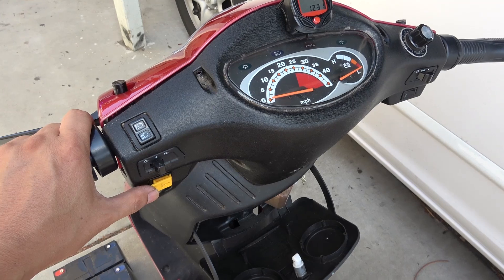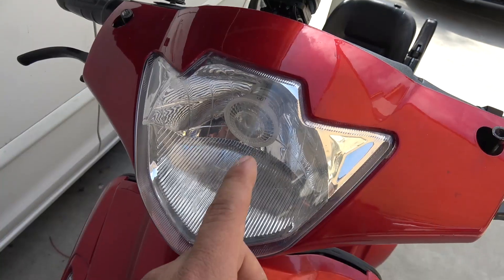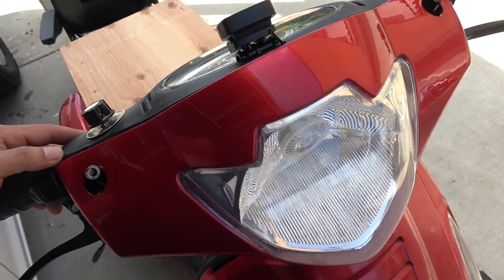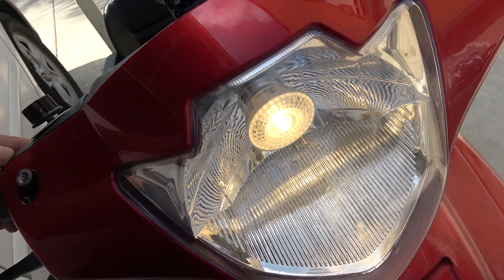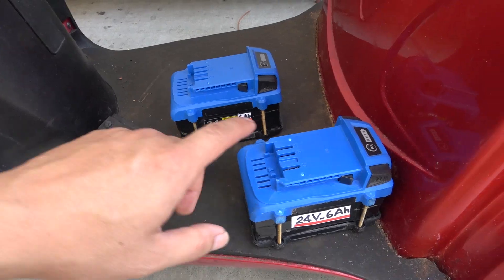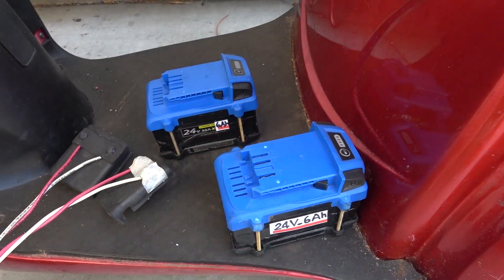I also installed a 12 volt car horn from my Corolla. Let's try it out — very loud! The front headlight has been replaced with a 12 volt LED landscaping light. Let's try and turn it on — at night it's very bright.